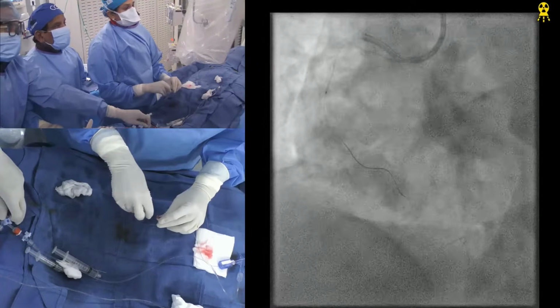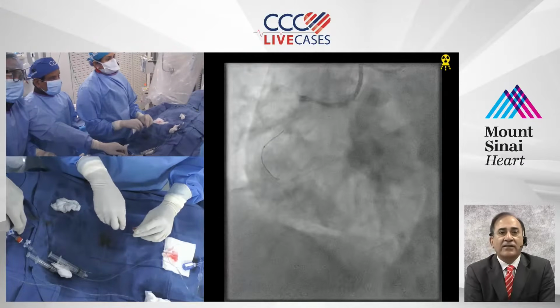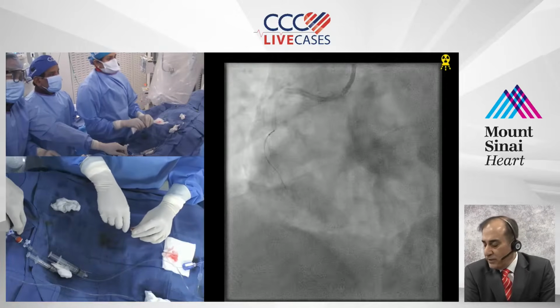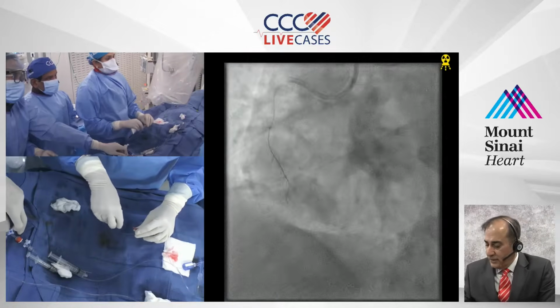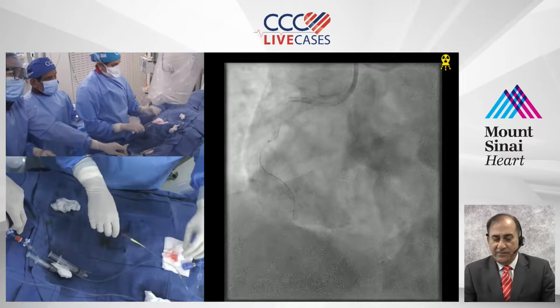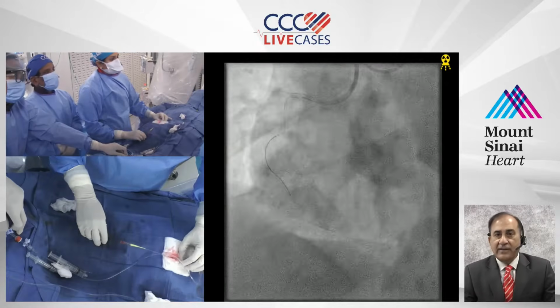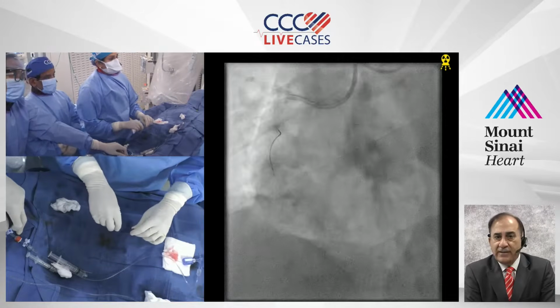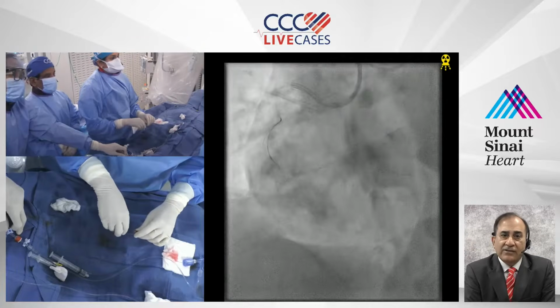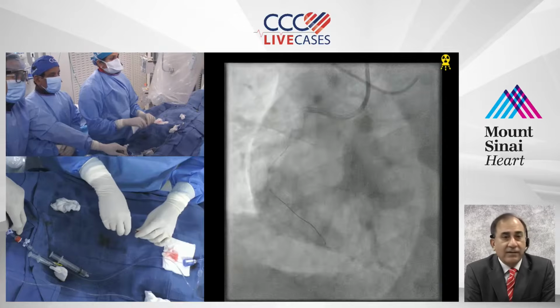Anu, so many people have complimented the app and the wire escalation strategy and the algorithm. Truly remarkable, and hopefully more and more people can go through this strategy and benefit from it. I have never seen an illustration of the wires done so nicely. And not only that, it's a guide to anybody. Even the manufacturer is listed.